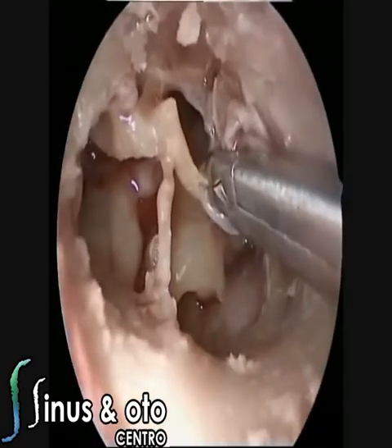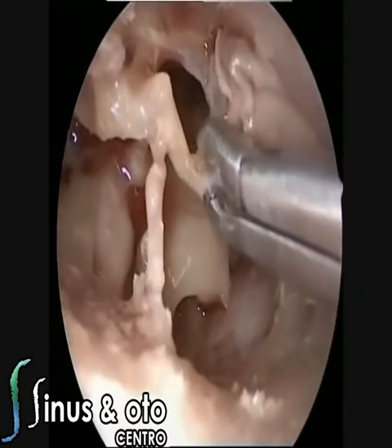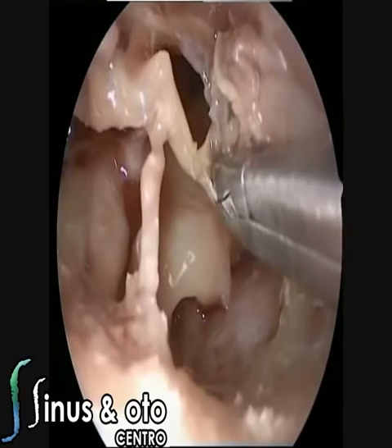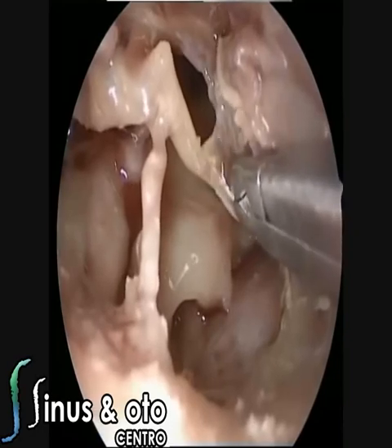So we are removing the remainings of the tympanic membrane from the umbo, which is the most difficult part to do, which is to remove the tympanic membrane from the umbo of the malleus.